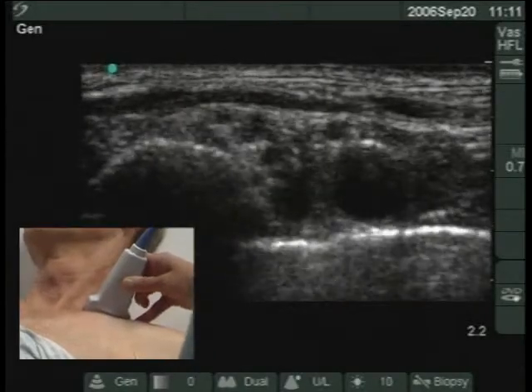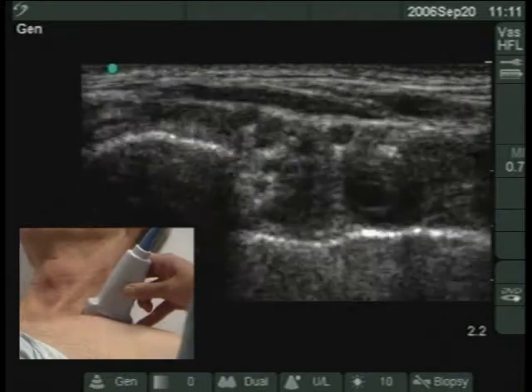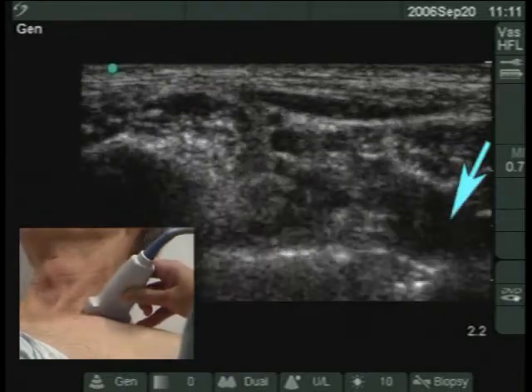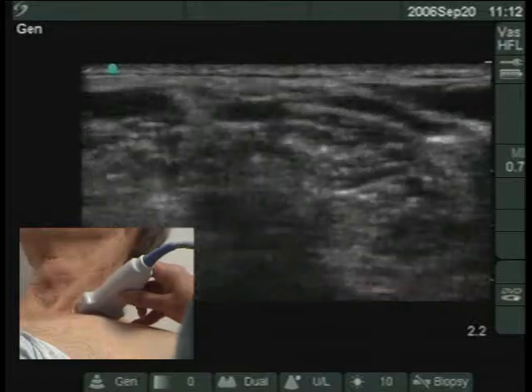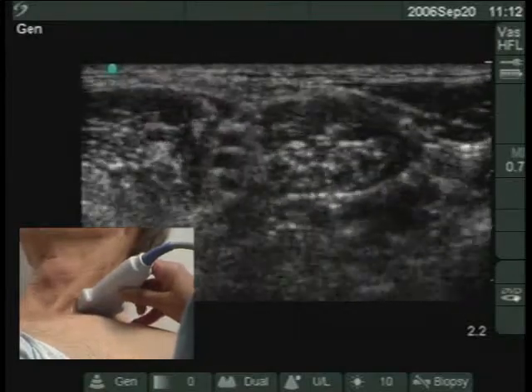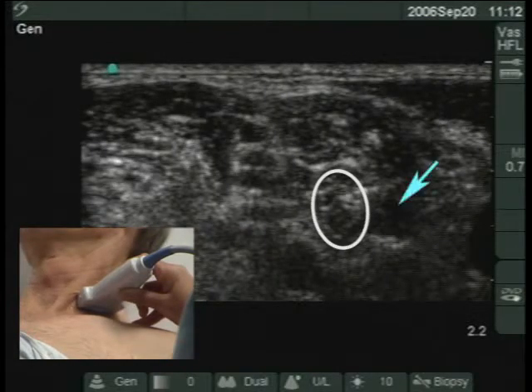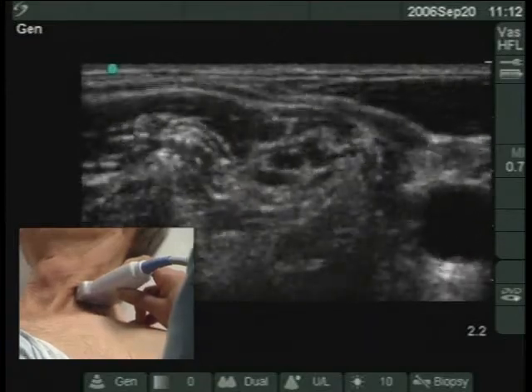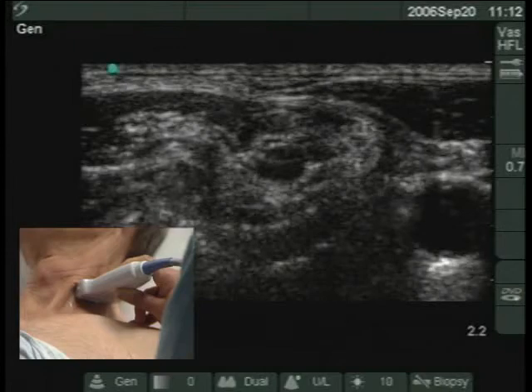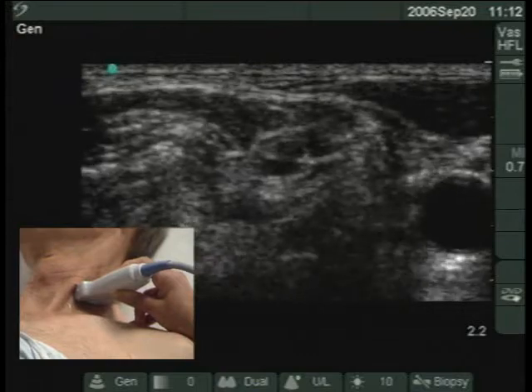Prior to beginning the sterile procedure, the brachial plexus is located using ultrasound. To quickly locate it, identify the subclavian artery and move the transducer superiorly along the interscalene groove. At the cricoid level, the nerves appear in cross section as a string of beads between the scalenus anticus and scalenus medius muscles. Continue superiorly and the trunks will separate into component nerve roots. Move the transducer laterally or medially so the neural structures are positioned in the middle of the screen.